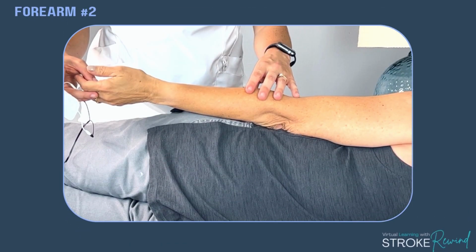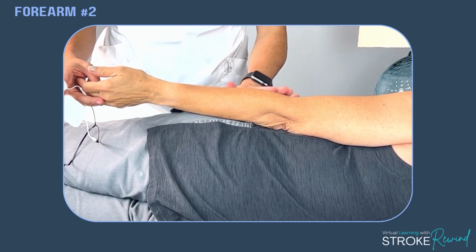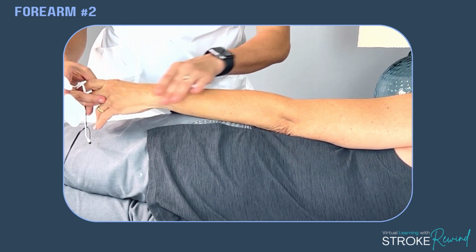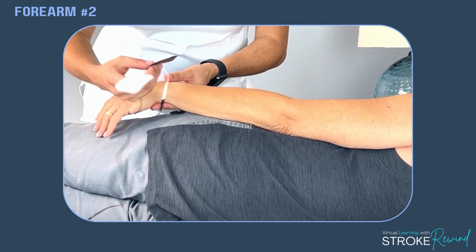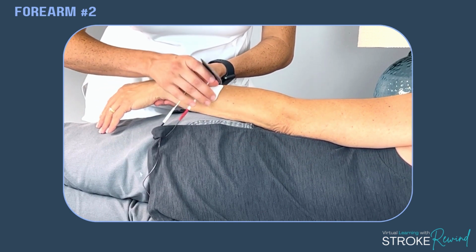So the second electrode placement for the lower forearm is the back of the forearm. So here's the front where the palm side is. So you're going to put the person with the palm down. I'm doing this demonstration on your side, but you can again do it sitting or on your back. So the back of the forearm, you're going to find a meaty part of the muscle.